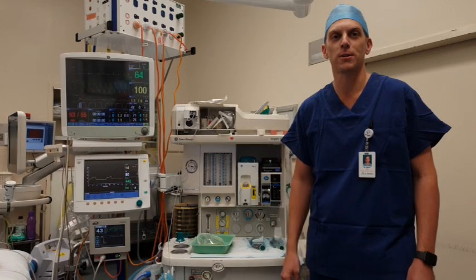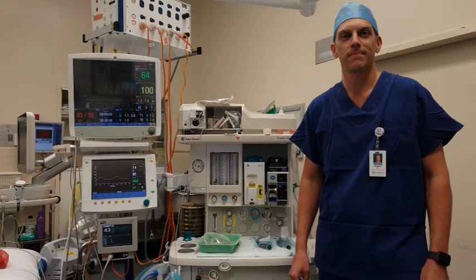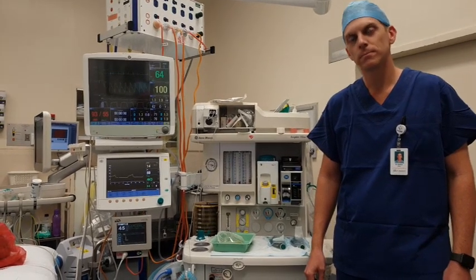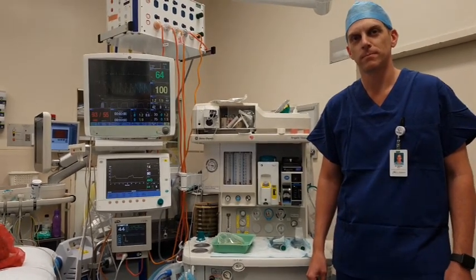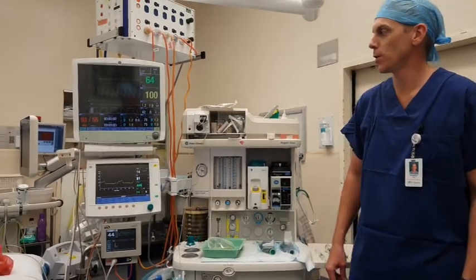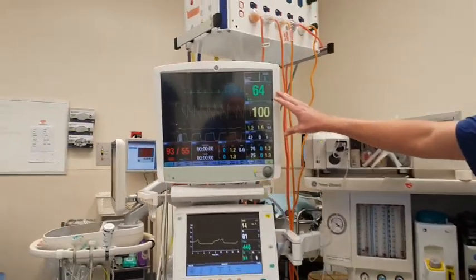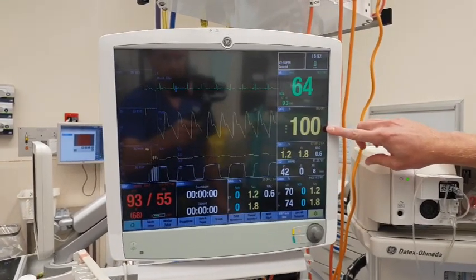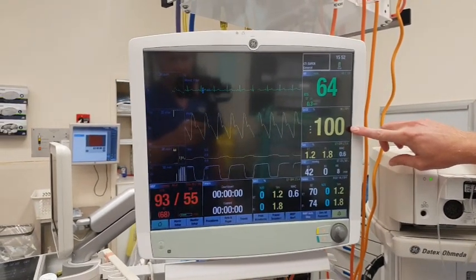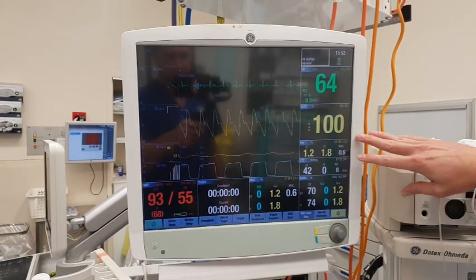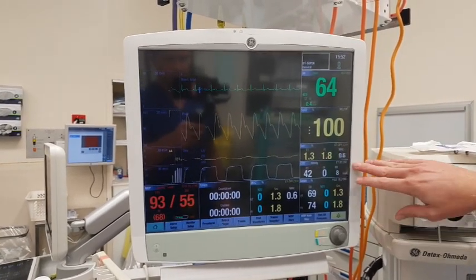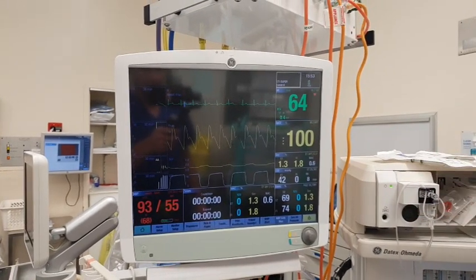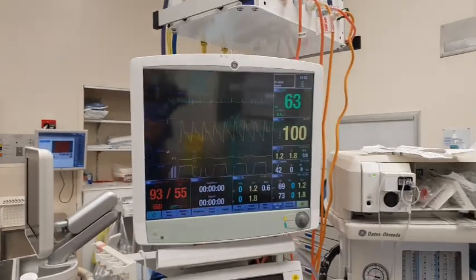Can you show us through some of the monitors quickly, and then look specifically at the BIS monitor? Sure. This is our main monitoring screen. On this screen we've got heart rate, oxygen percentage — in this person it's 100% — and other gas analysis including carbon dioxide. That's the main monitoring screen that we keep.